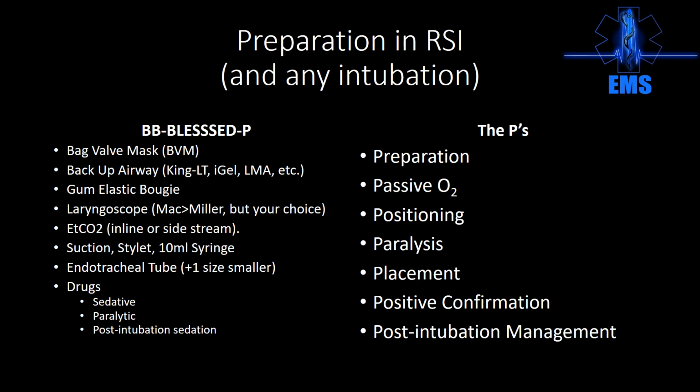So we're looking for the mesa, right? We're looking for the plateau, followed by the drop-off, followed by the sharp incursion, followed by the plateau. That's great. You can still get that with the tube in the back of the throat. I've seen it happen where the tube was not in the trachea. It was just butted up, juxtaposed against the trachea, and I had a beautiful end-tidal CO2 readout.